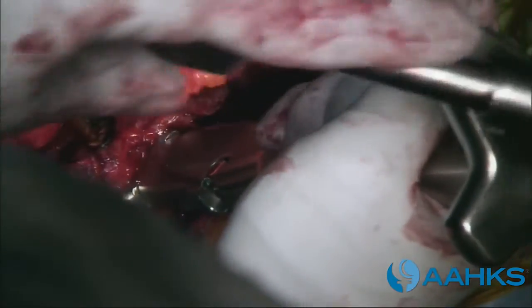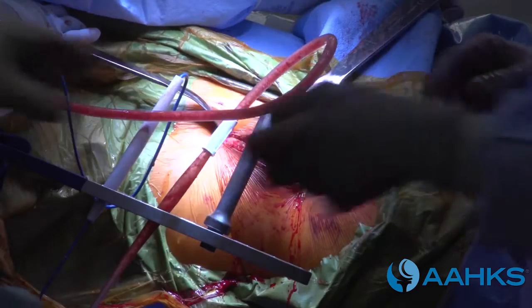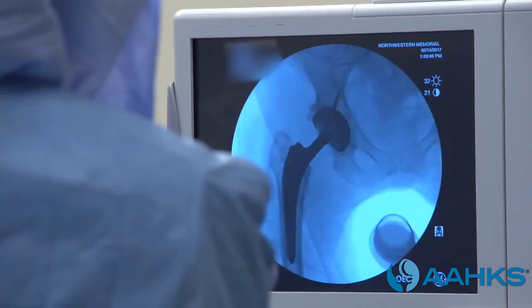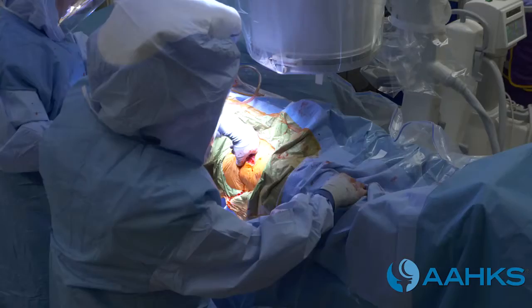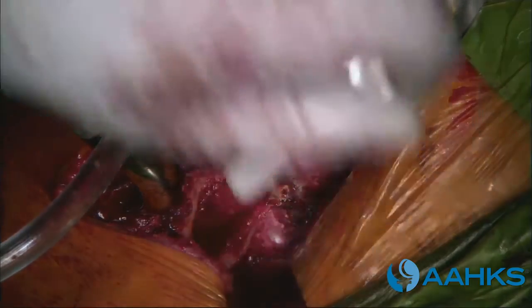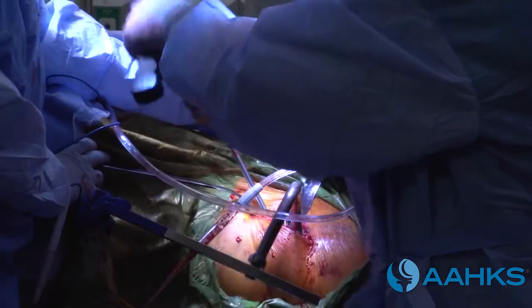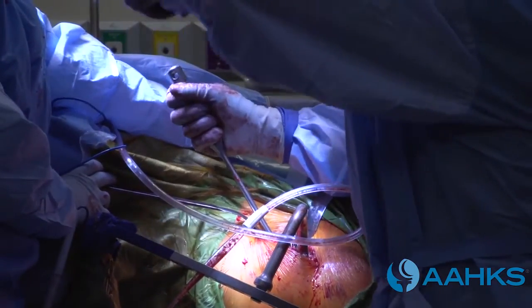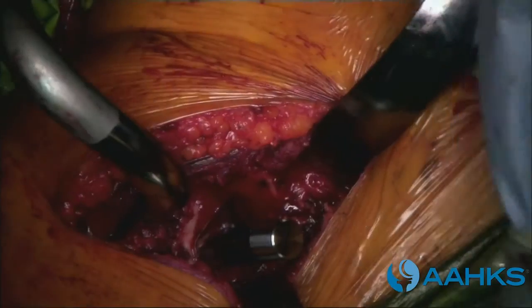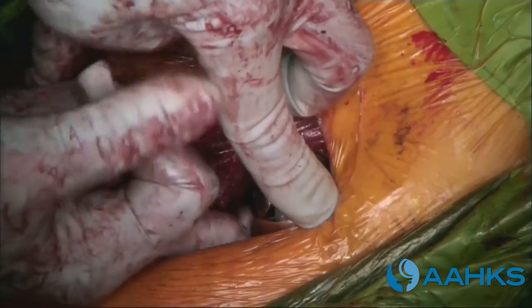Next, the surgeon prepares the femur. Trial implants are inserted to make sure an exact fit is achieved. Your surgeon may use X-rays to check positioning and fit of the implants. After checking and approving the motion of your leg, your surgeon will move on to inserting the final implants. The stem of the implant is inserted into your thigh bone. A surgical mallet and other tools are used to seat them firmly in place. The ball is placed on the stem. Your surgeon checks the motion of your new joint.